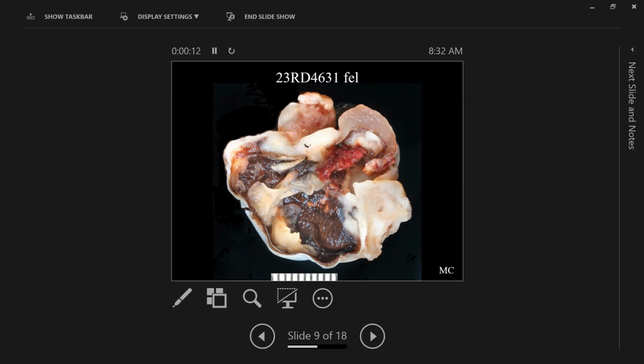The next case is a 9.9-year-old spayed female domestic short-haired cat. And all they say for the history on this eye is that there's a large rupture with bulbous iris bulging outward. That is our description clinically, and I think it's pretty apt. So this globe is very, very distorted, and mostly because I have the histologic picture for you, I can find my anatomic landmarks, but otherwise it's very difficult because it's quite a distorted globe.